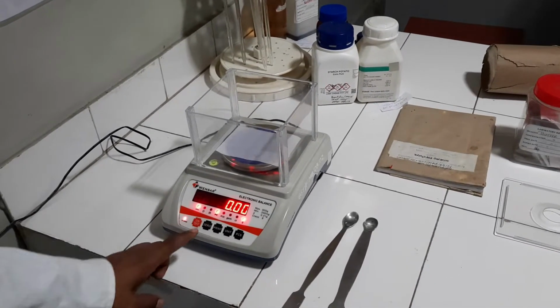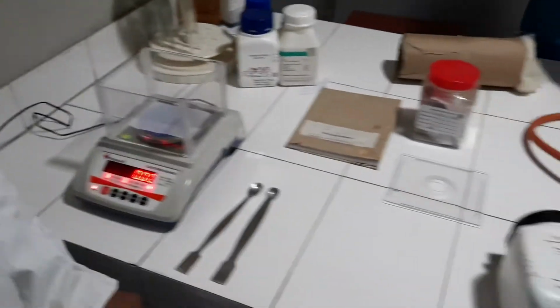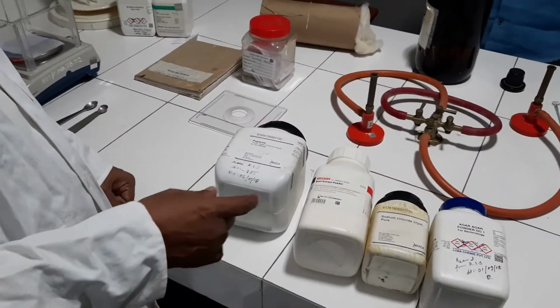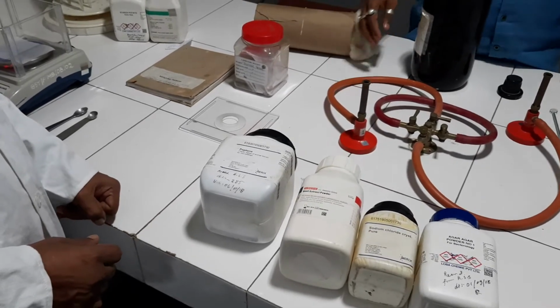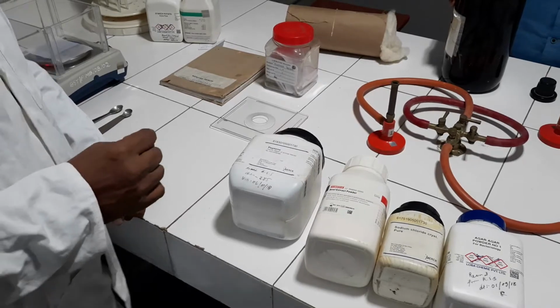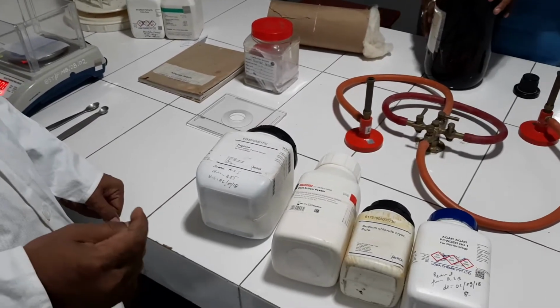We tare it. Now we will take these weights individually and put them in a conical flask, and we will get the media.